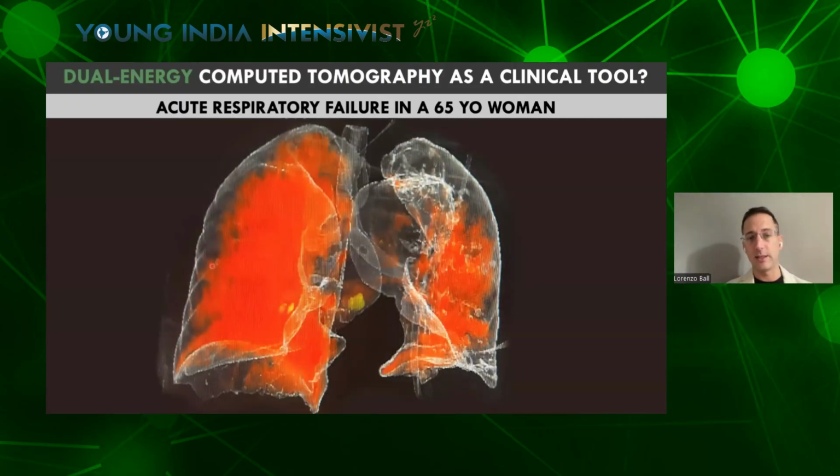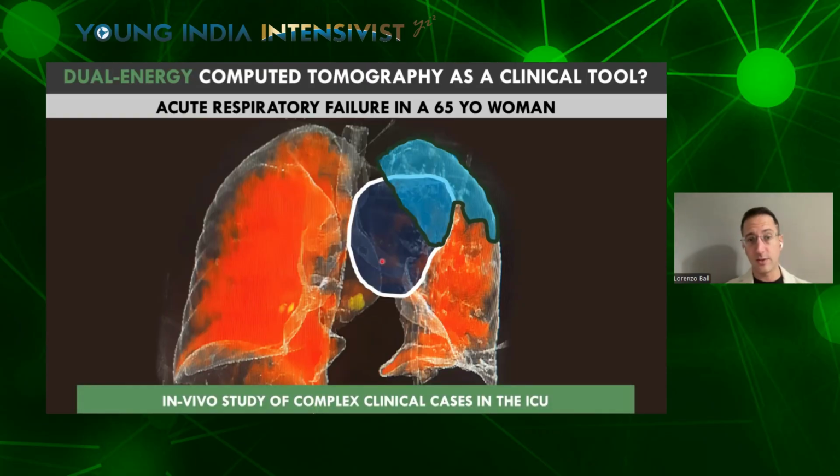And as you can see, this is a 3D reconstruction of the distribution of blood in a patient who has a huge mediastinal mass compressing partially both the left artery and the left main bronchus, resulting in a very heterogeneous distribution of ventilation and perfusion with dead space areas and also areas acting as a shunt. Based on these images, we decided to intubate the right bronchus to let hypoxic vasoconstriction act on the left side, and this allowed the patient to go safely to the surgical removal of the mass.